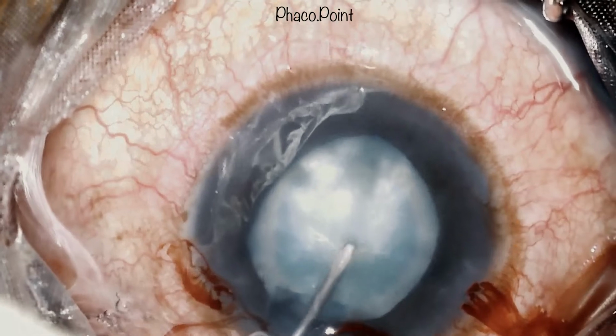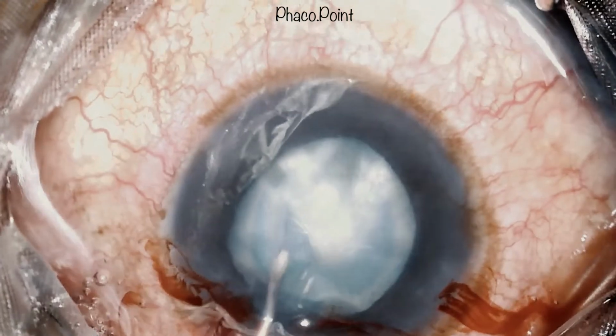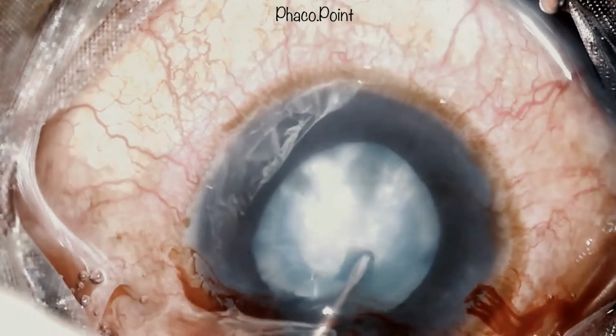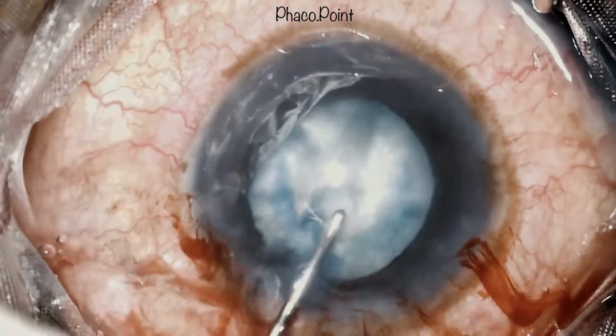Now, in an intumescent cataract, I like to do a double rhexis, wherein I generally create a small rhexis, wash out the intumescent fluid, reduce the intralenticular pressure, and then proceed to creating the second rhexis. This is what you'll see in this part of the video.